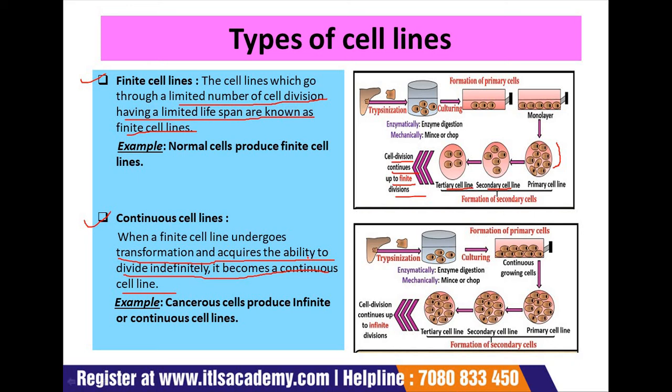You can see in this picture, it again starts with the trypsinization method, and enzymatically we use enzyme digestion and mince or chop the tissue, and culturing starts here.